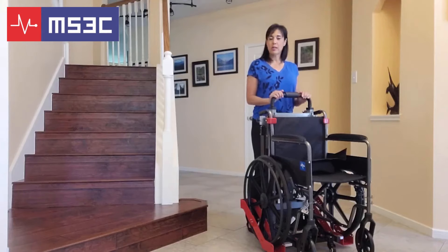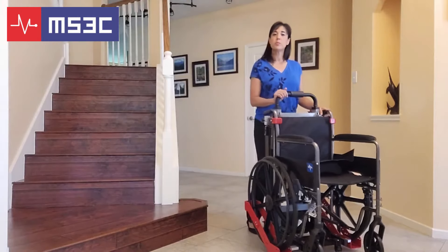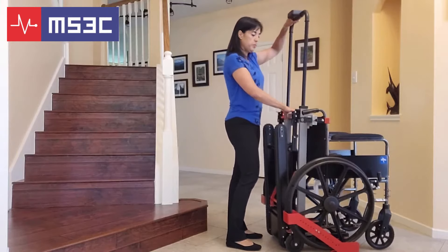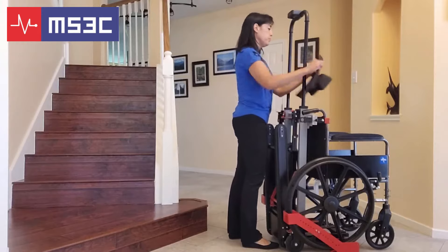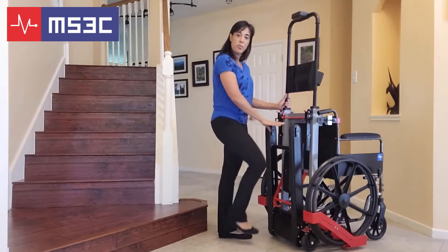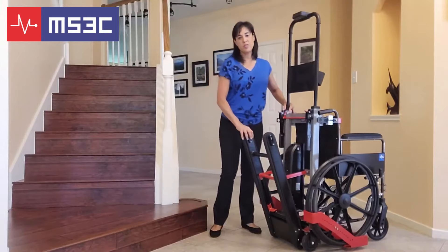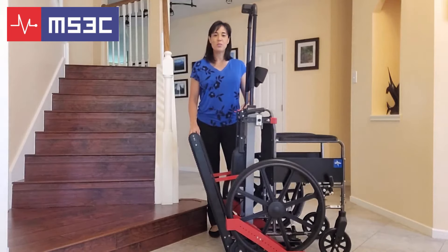Now that you have your trolley properly adjusted for your chair, we are going to show you how to use it on the stairs. First, extend the telescoping handrail by squeezing the red lever across the back of the chair and lifting. Install the headrest onto the uprights with the Velcro. Next, engage the tracks by pushing the red lever at the back of the chair. Then position the unit up against the back of the stairs. Stay tuned for a short demonstration.